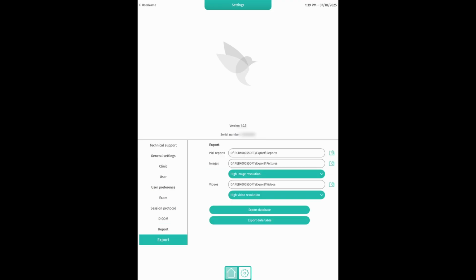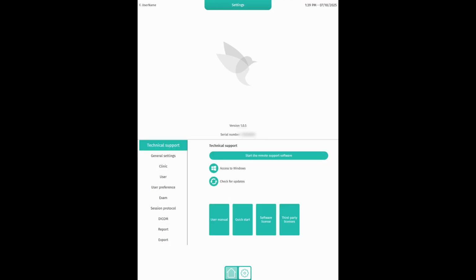And also you can change the language, as you already witnessed. You can also do upgrades manually here, and it's very straightforward. You just click it and then the machine resets, and you don't have to pay for it. You can do it yourself. It's very important because, for instance, part of this movie was done on the 105, then I upgraded this, and then on the 107 version you already have the progression. You also have more information about the blinking areas not covered, and also lipid thickness.